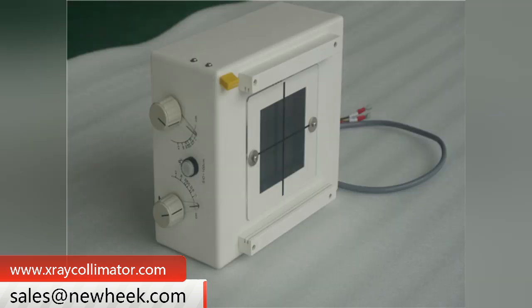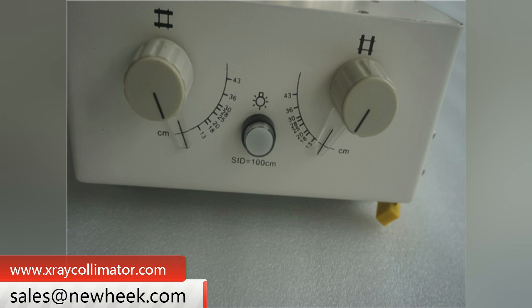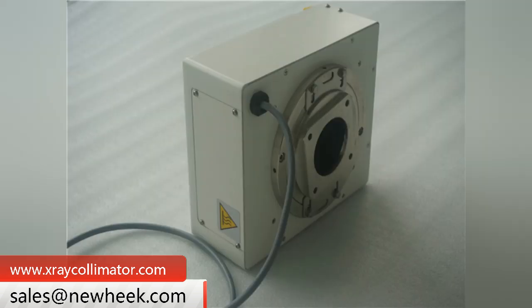The knob on the panel can control the blade. The calibration value of Nuheek beam limiter products on the panel allows the user to read out the size of the field of view based on this data and set it by himself with a knob.